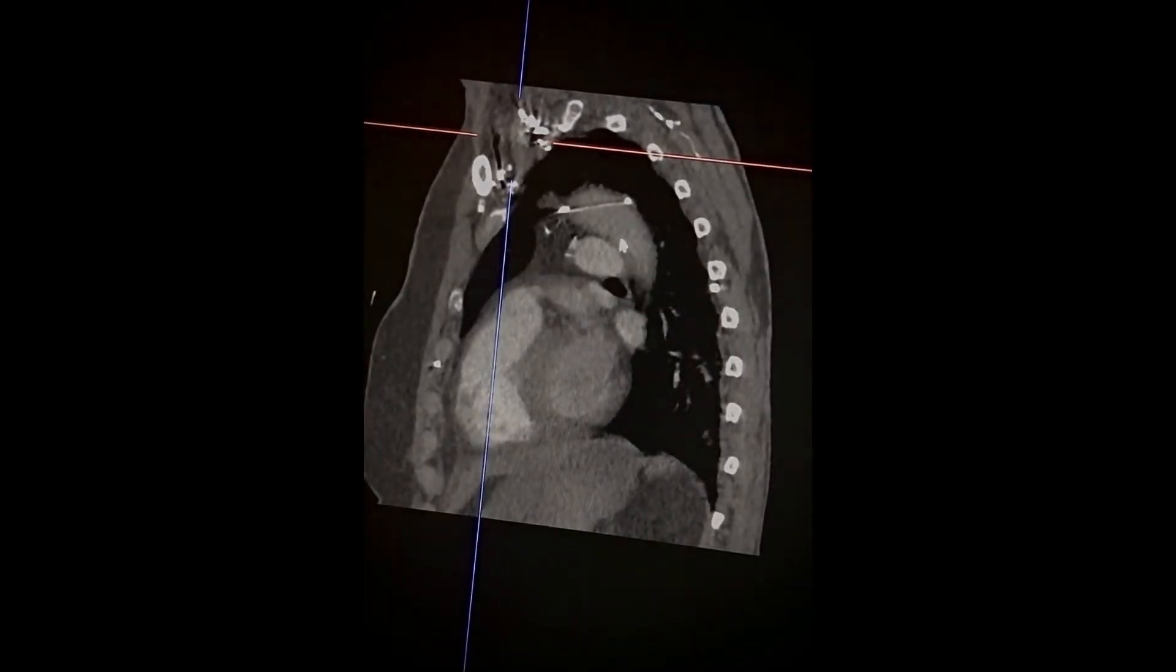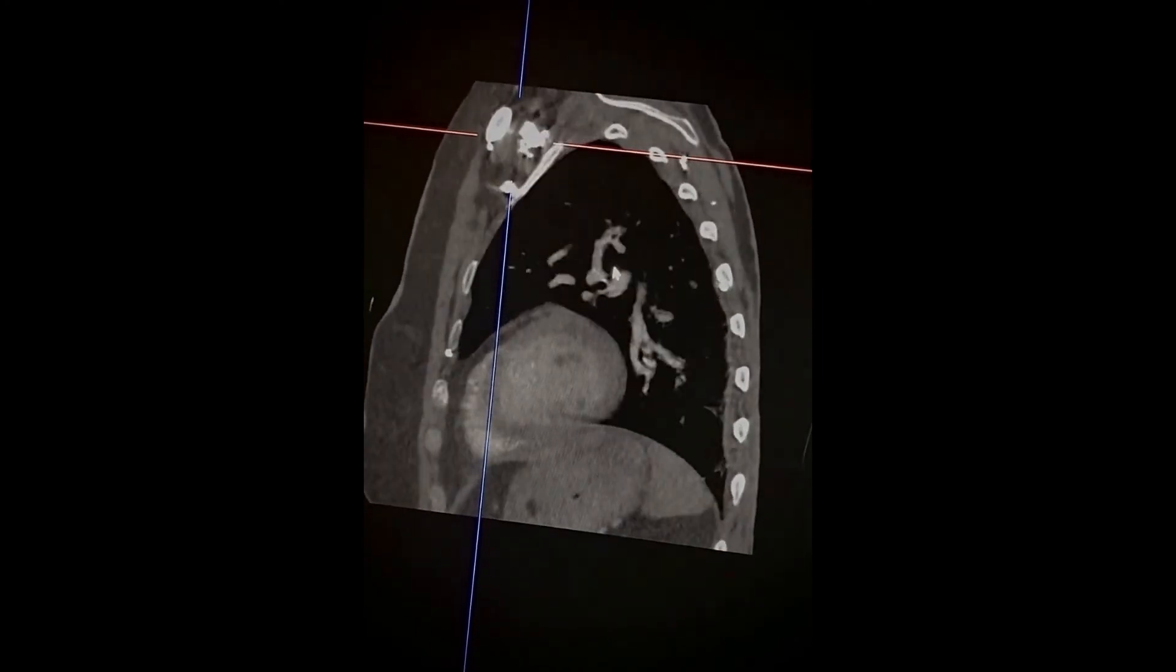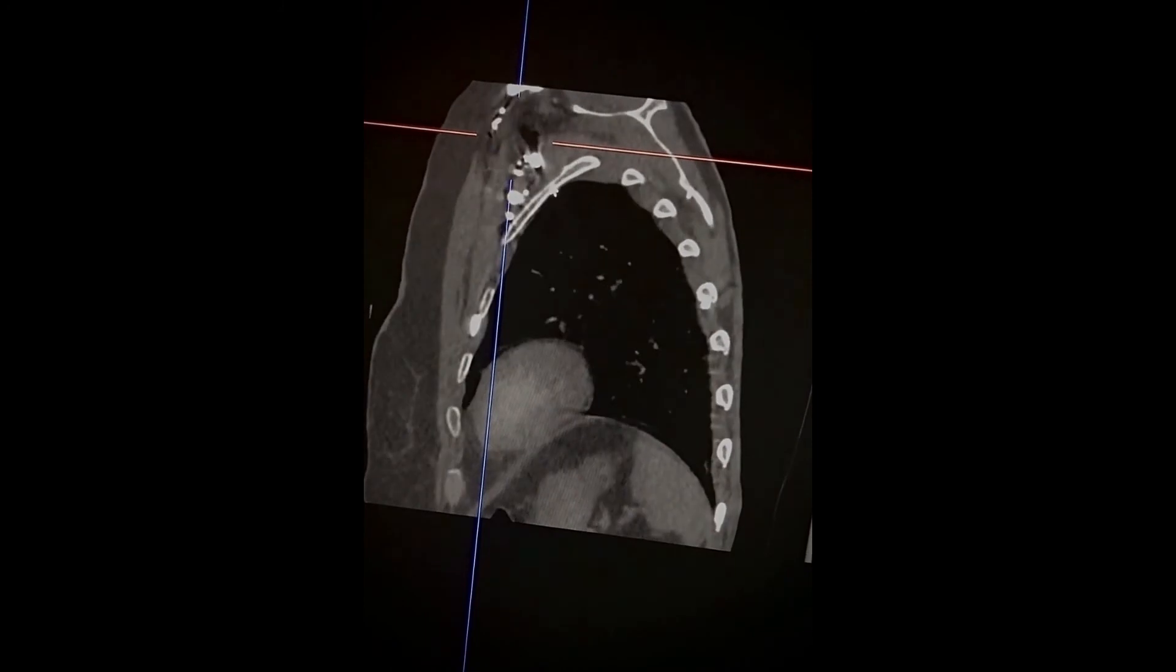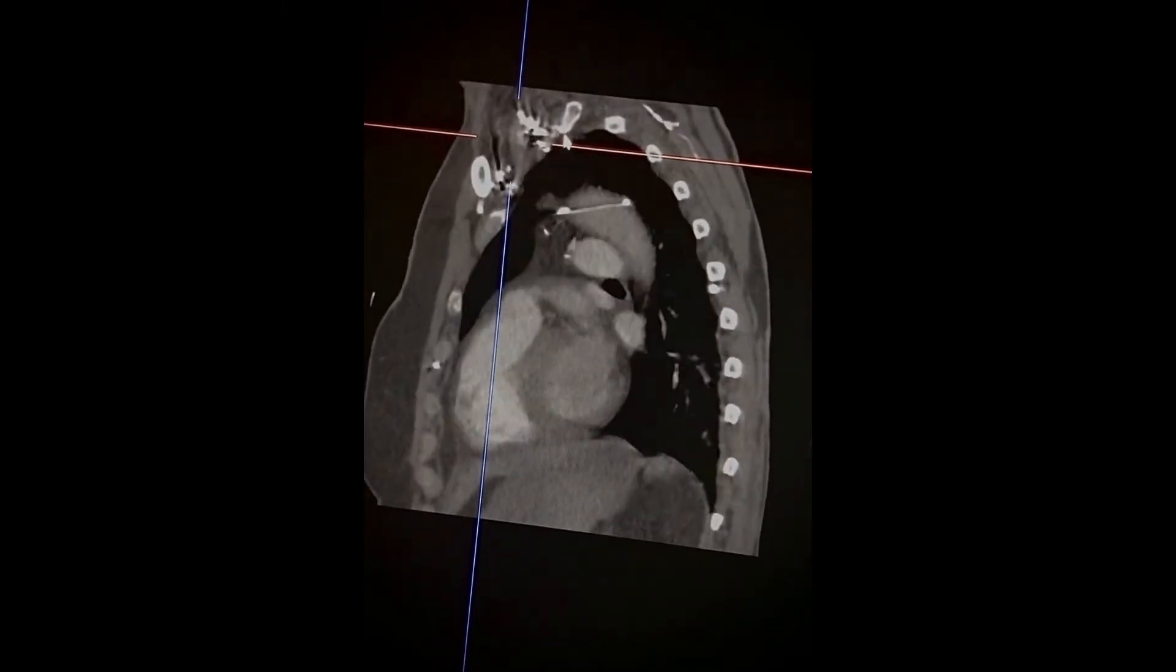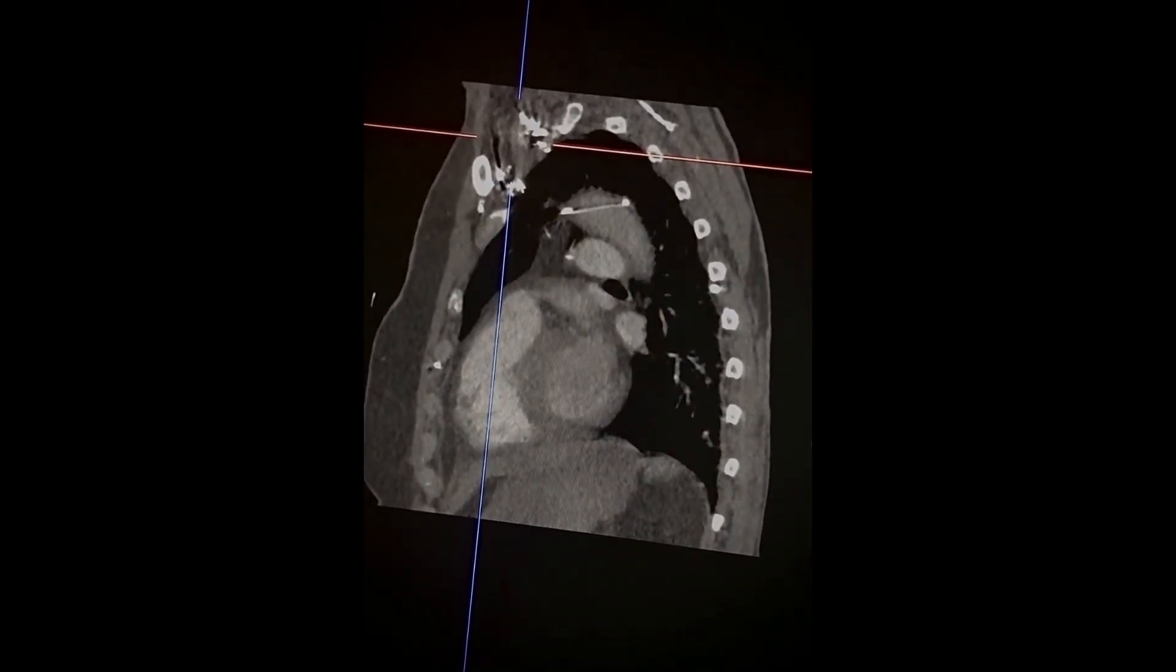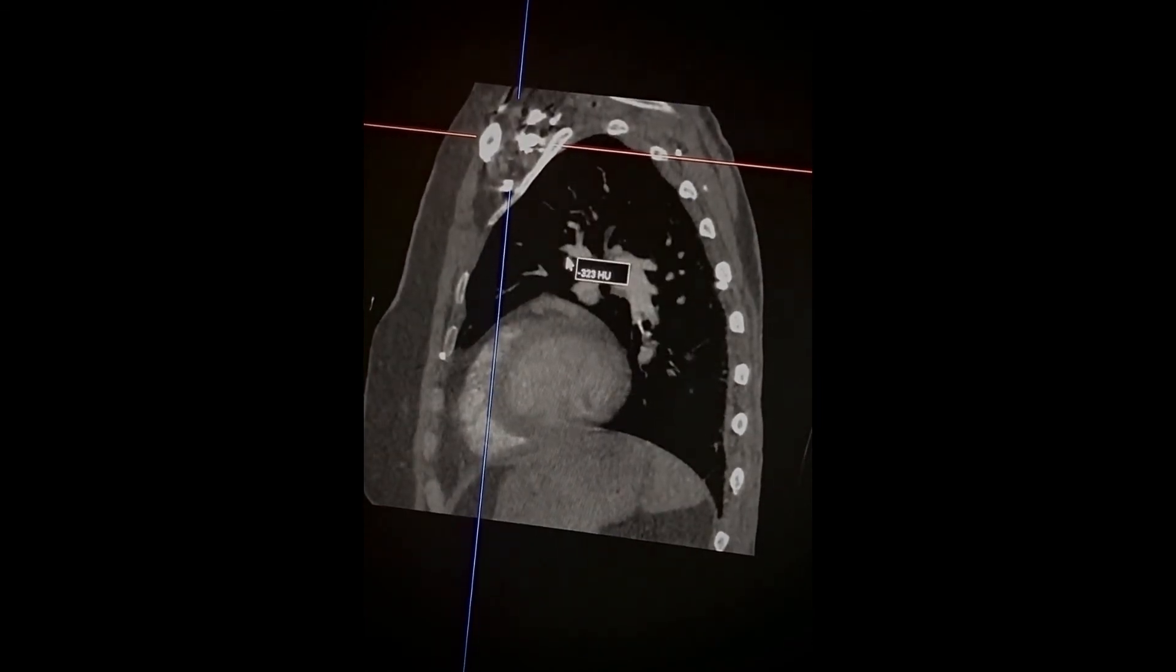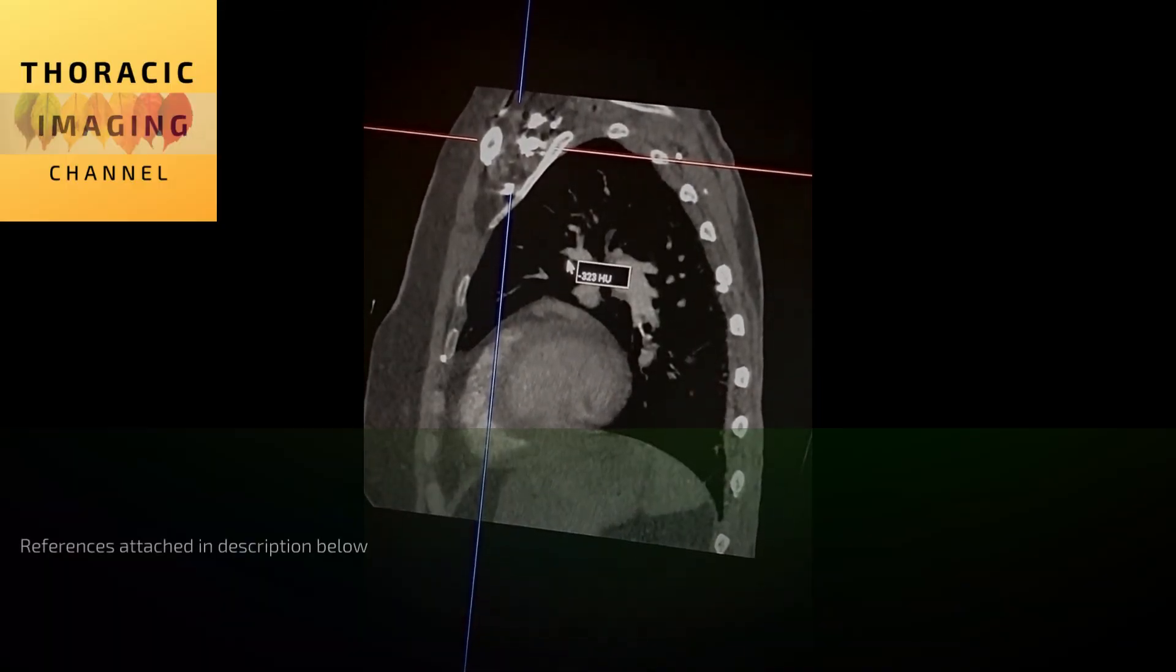In this case, it is most likely that this obstruction is due to a fibrous band or the orientation of the scalenus anterior and middle muscles against the first rib. References containing important links have been pasted below.